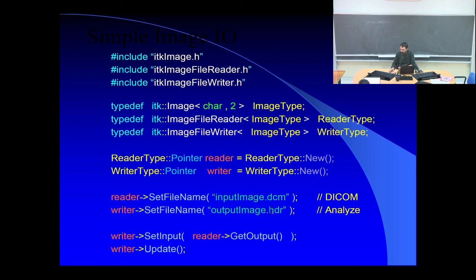It's not DICOM, it's an Analyze file, a header file it's called. Yeah? Just by saying the extension, ITK will know the format you want to write to, and then it will write it correctly. Okay? What else? The writer, you need to connect.